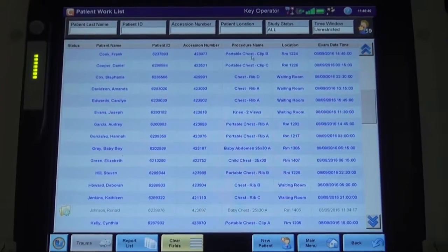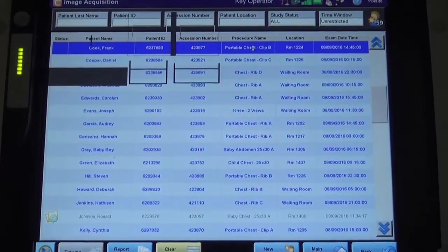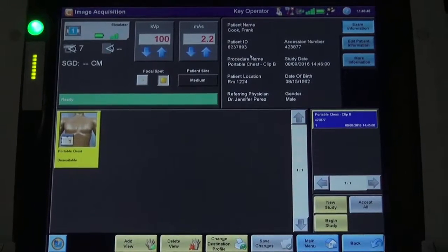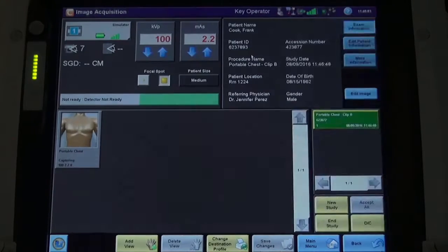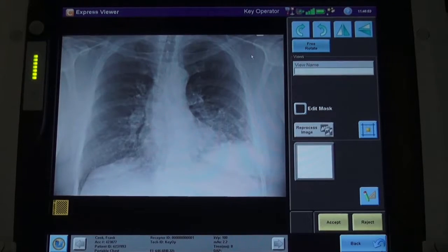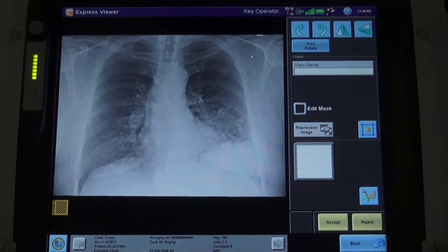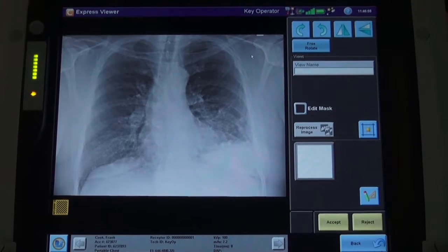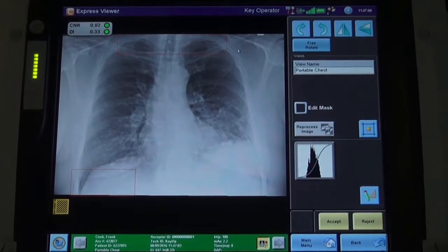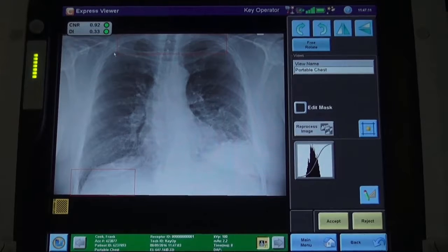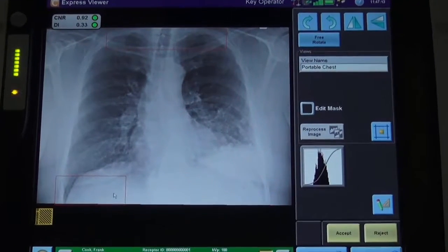The Tech Assist option available in the DirectView software is designed to assist the radiographer in making informed decisions about image quality on chest examinations. When a chest examination is acquired, the Tech Assist feature will provide a notification to the user in the event that the lung fields may not be fully contained within the image, by displaying a red box around the questionable area. This box is designed to draw the radiographer's attention to a specific area of the image for further review.